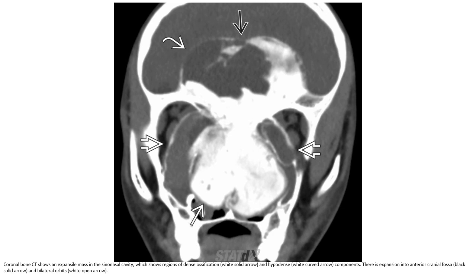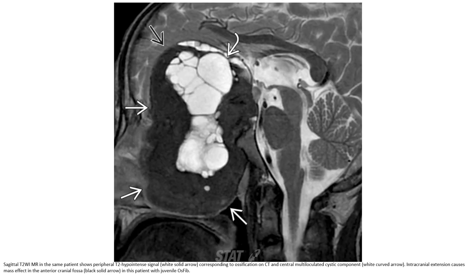Bone CT shows an expansive mass in the sinonasal cavity, which shows regions of dense ossification and hypodense components. There is expansion into the anterior cranial fossa and bilateral orbits. T2-weighted MRI in the same patient shows peripheral T2 hypointensity corresponding to ossification on CT, and central multiloculated cystic components. Intracranial extension causes mass effect in the anterior cranial fossa in this patient with juvenile ossifying fibroma.